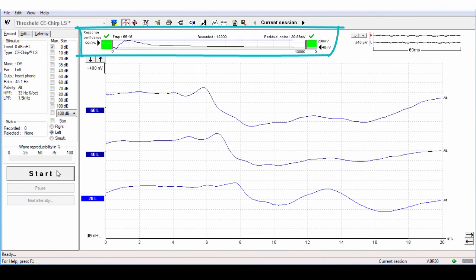I know that this recording was prepared especially for today's webinar, and one of the instructions I gave them is: try to be a noisy patient. Otherwise the measurements would go far too quick and I had nothing to talk about. But in this example, I would say even though the patient was maybe still noisy and the noise had not reduced to the bottom, if you are so confident about the peak being there and it's confirmed by the FMP, then you don't need to waste time. You can already continue before you reach the low noise levels.